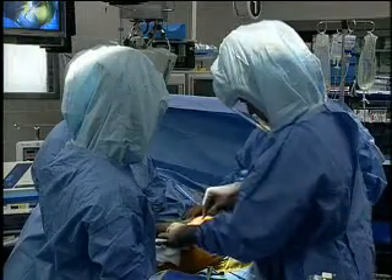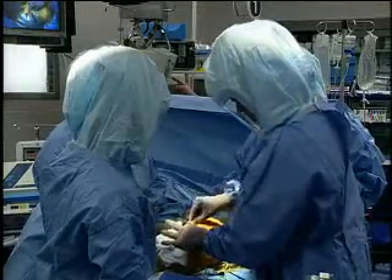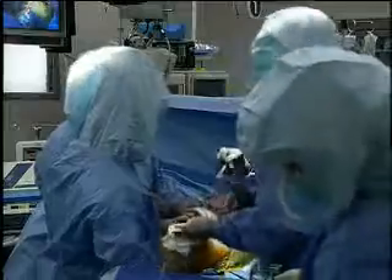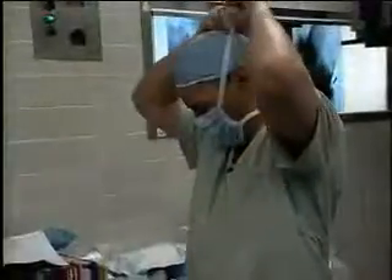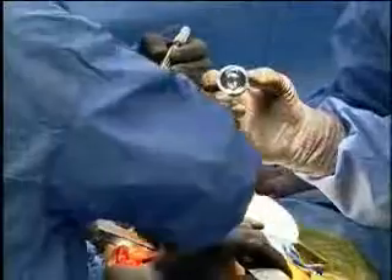With Sharon's first surgery, she was given a metal-to-plastic prosthesis in her left hip. Over time, some of the plastic particles broke off, requiring more surgery. When Sharon learned that she would need her right hip replaced, orthopedic surgeon Dr. John Kukler at the University of Alabama at Birmingham suggested a metal-on-metal prosthesis.